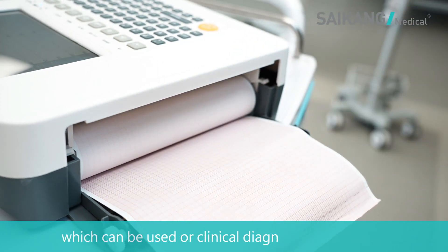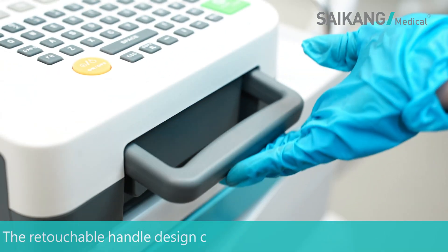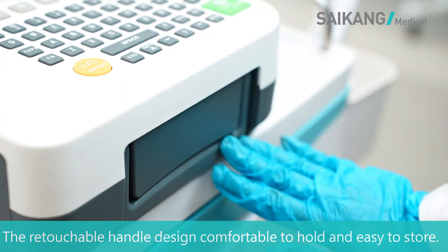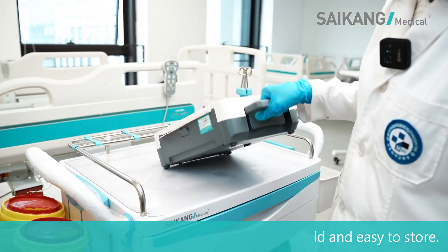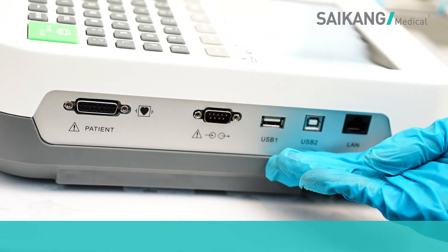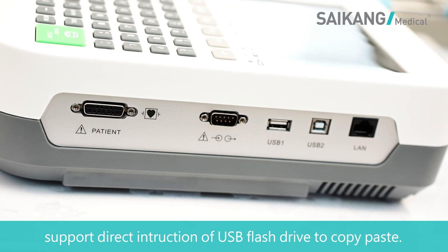With very clear and accurate records of ECG waveforms, which can be used for clinical diagnosis and research. The retractable handle design is comfortable to hold and easy to store. The built-in USB interface supports direct insertion of a USB flash drive to copy data.